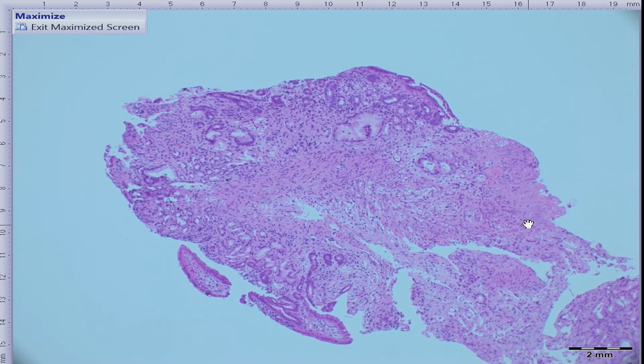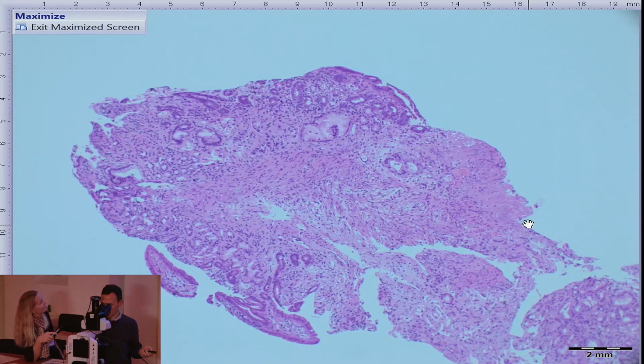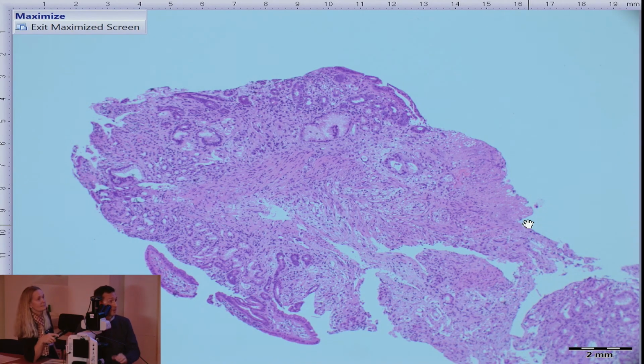In this biopsy, we have, I think, some loosely arranged abnormal cells in the lamina propria. Yeah, well, they're here and there admixed with inflammatory cells and reactive stromal cells, but we feel quite certain that cells like these represent the adenocarcinoma from pancreas, and that they actually have invaded the duodenal wall.